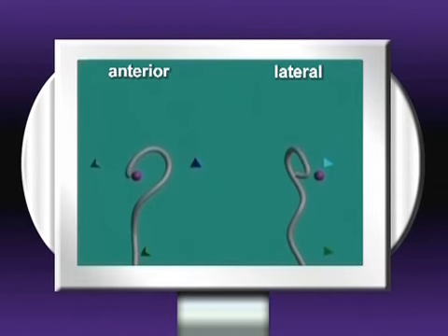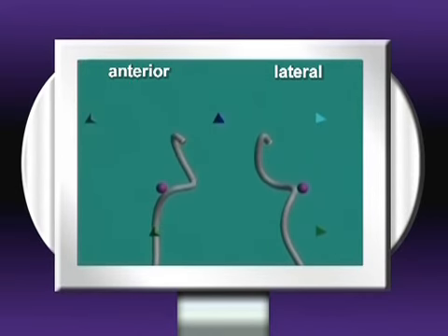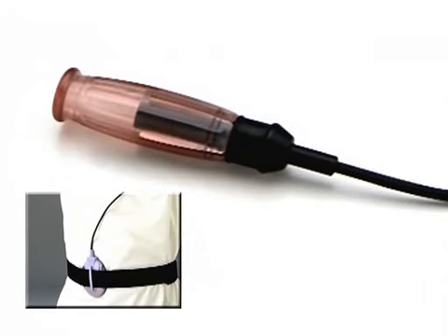Scopeguide can easily be switched to show the lateral view as well as the usual anterior view. This combined view shows the 3D shape better. It also helps decide whether a loop passes sufficiently anterior to allow hand pressure to compress it. If in doubt, a hand coil can be used by the assistant to target the exact point which best opposes the loop and makes scope insertion more efficient.